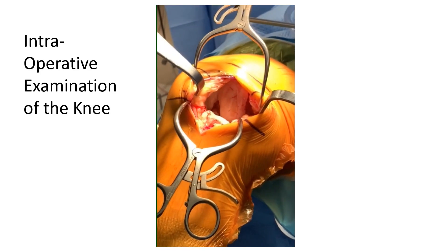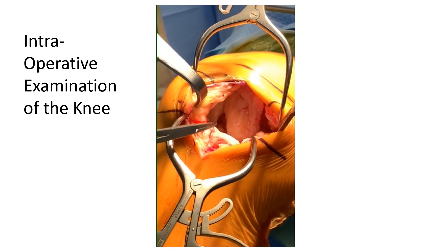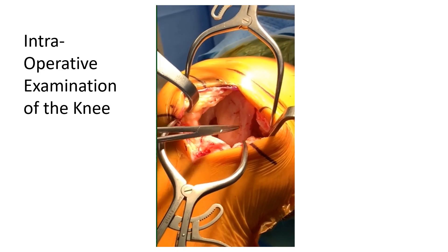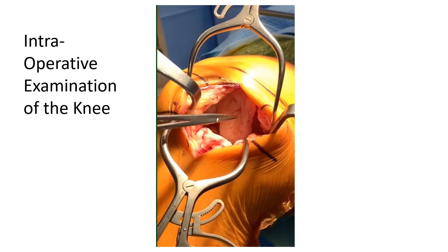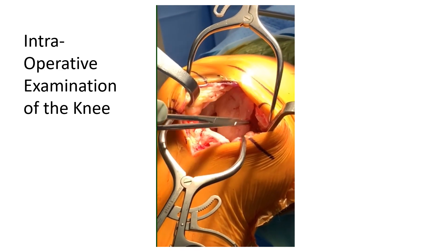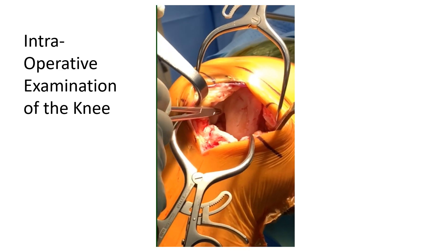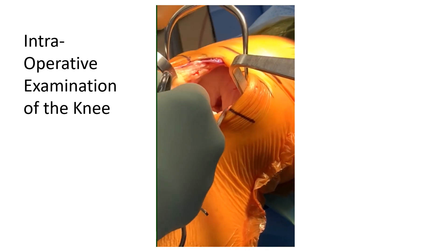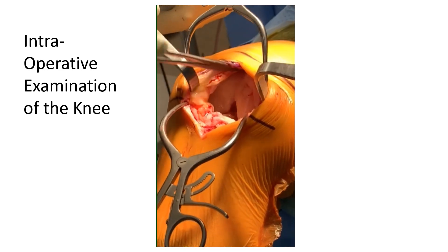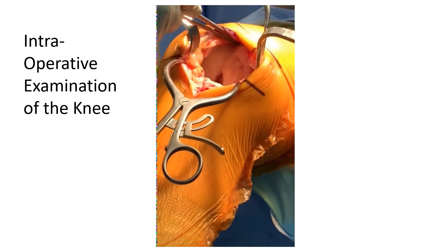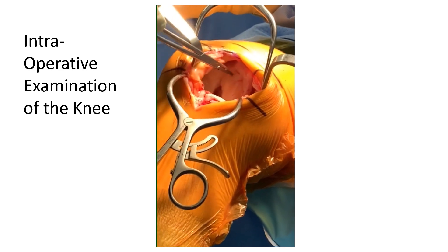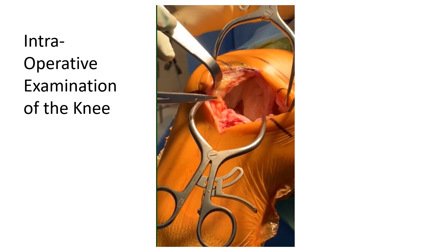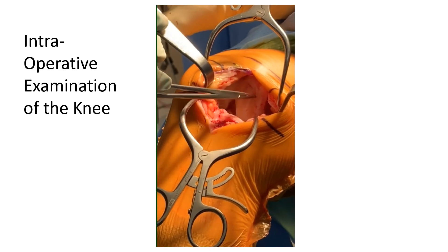This is the incision, and you can see we're looking deep into the knee. This is the medial side. This is the bone on bone. There's cartilage here. These are osteophytes all along the rim. This is the notch. We can see the cruciates are intact, and we can also see the opposite side is pristine, as well as the trochlear groove. So this is isolated medial disease that we see on the CT and like we saw on the x-ray, and we're going to go ahead and fix this.